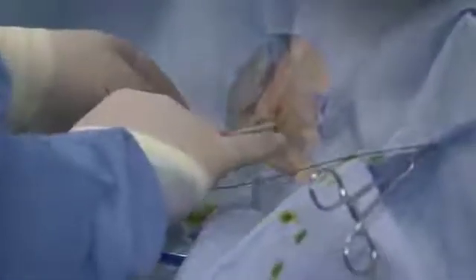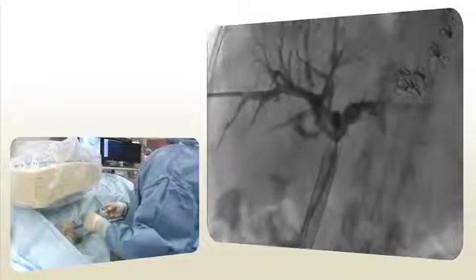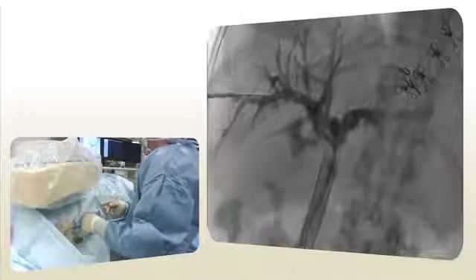A vascular sheath is inserted over the guide wire into the patient. Contrast is injected through this sheath to help opacify the biliary system. Under fluoroscopy, I am able to confirm that contrast can flow down the stent into the duodenum.